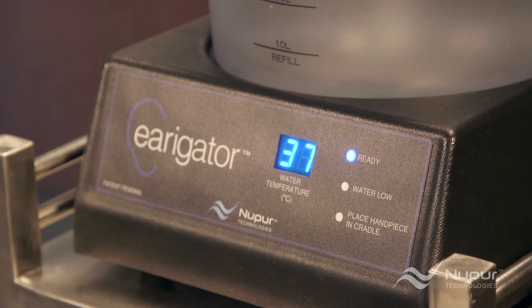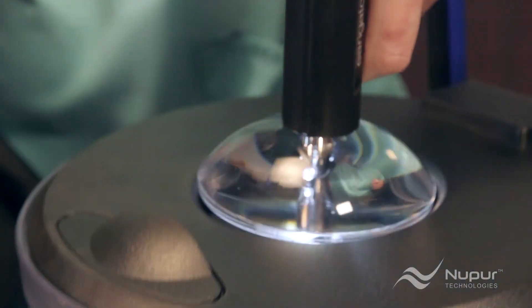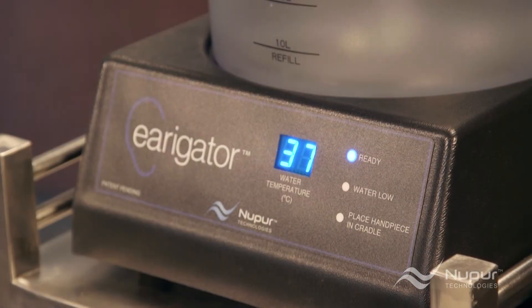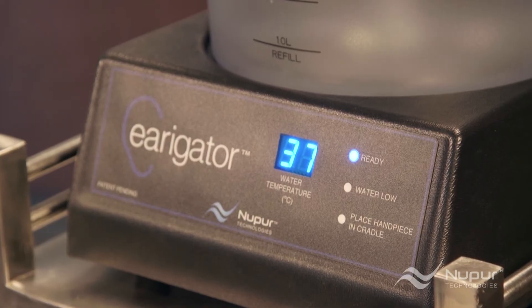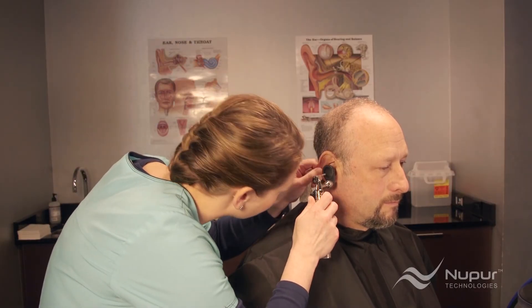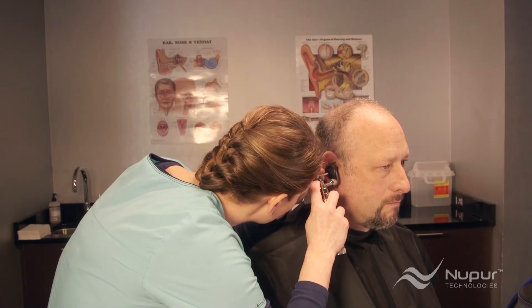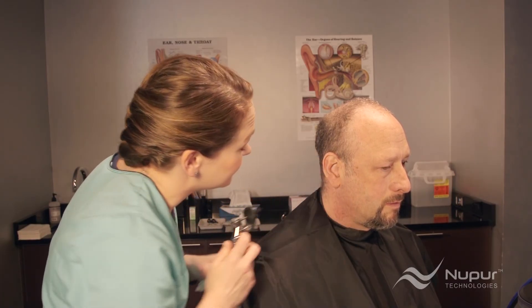If the irrigator remains unused for more than one minute, you should remove the nozzle and place the handpiece back into the cradle. This ensures that the water temperature in the handpiece remains at body temperature. Rachel inspects the ear with the otoscope and concludes that the earwax has been removed. If there was more to remove, she would use up to three washings on the one side, filling the catch basin three times, to remove all earwax.